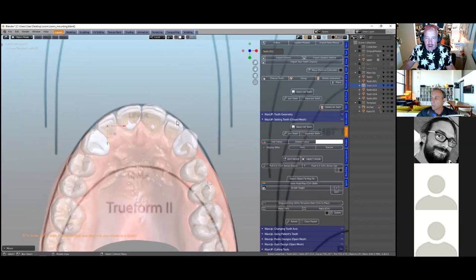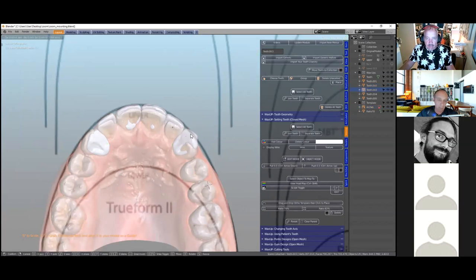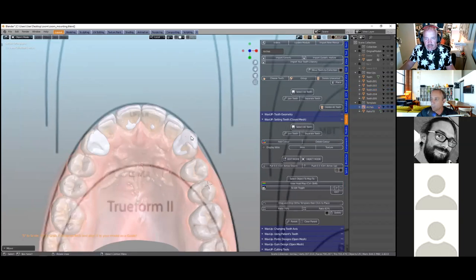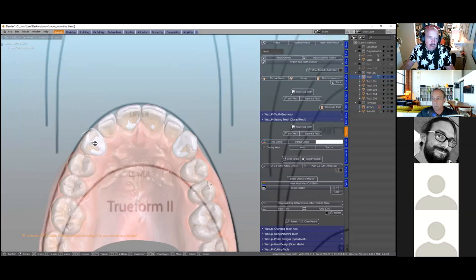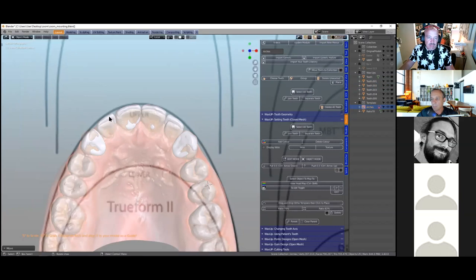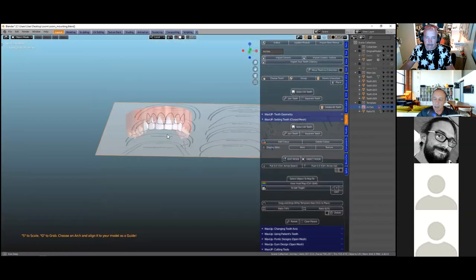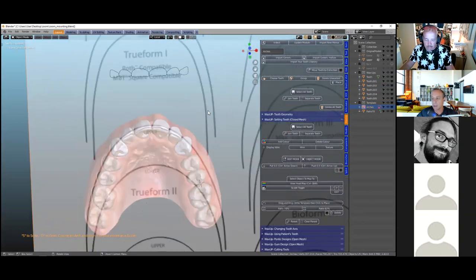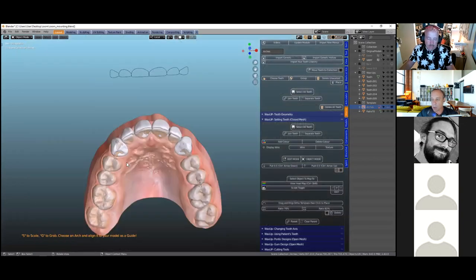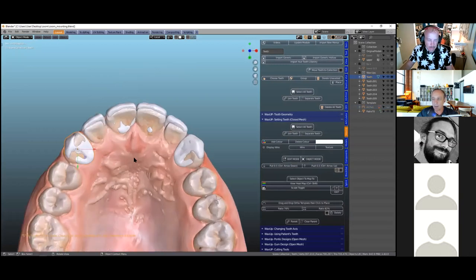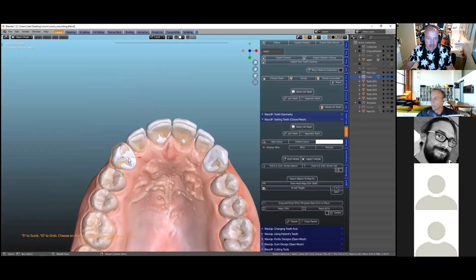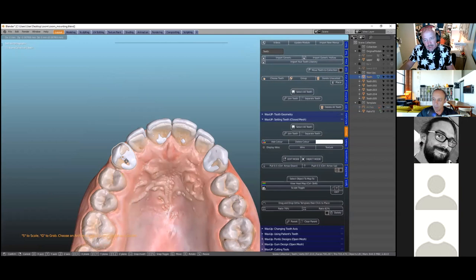We're moving the teeth around — that's basically what we do with diagnostic wax-up: moving teeth from a tooth library into position. The tooth library requires focusing on each tooth as its own entity, but you can also join and unjoin them. Having flexibility to work with each tooth individually is a key part of it — you need to be able to join them and unjoin them.